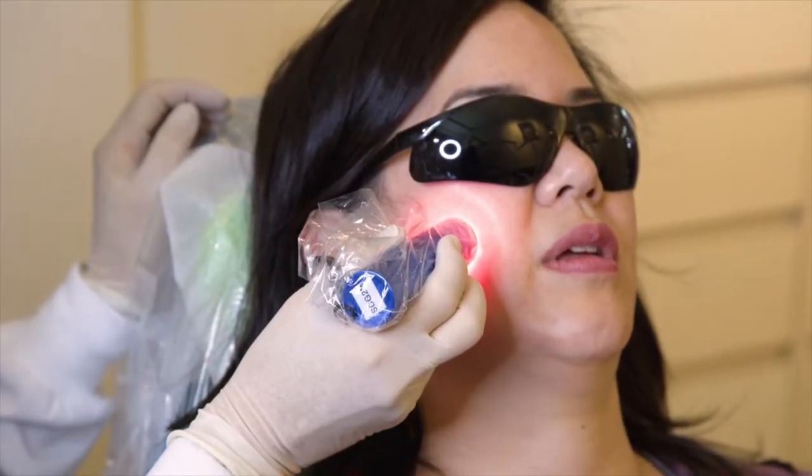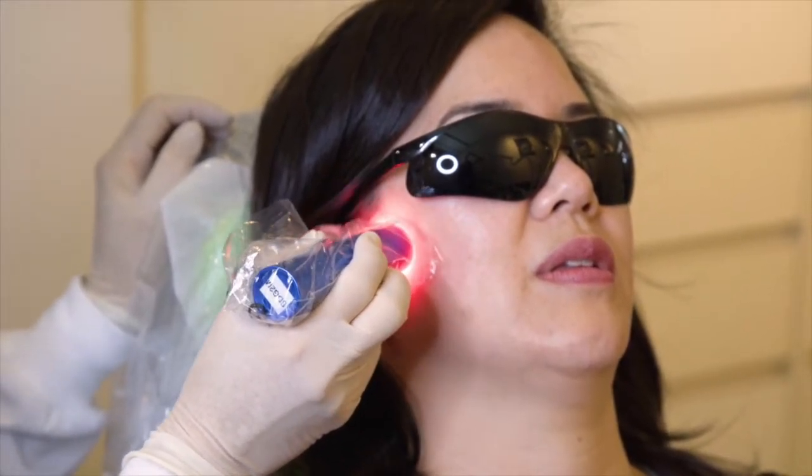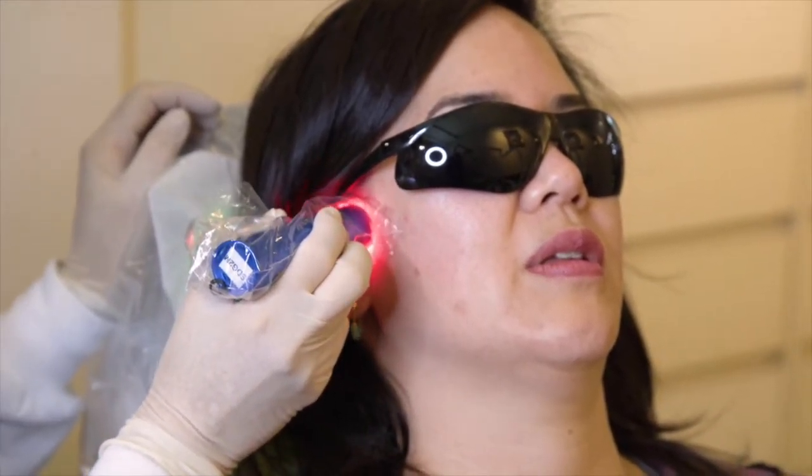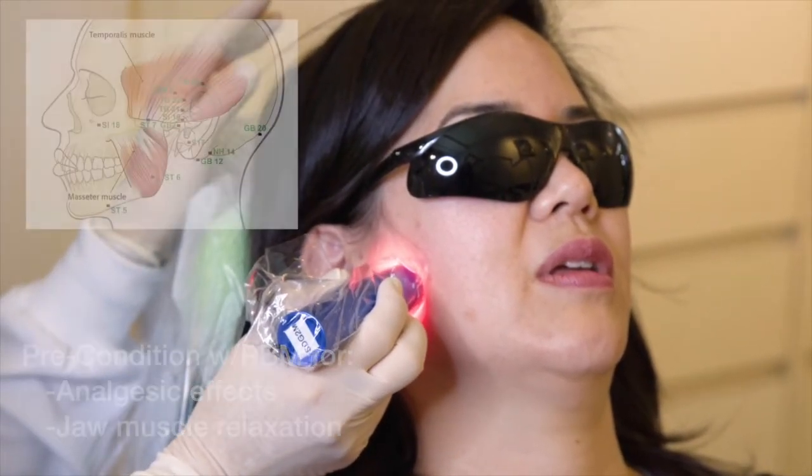You can see the light — it's got good coverage on the area. Most of the time for general dentistry, what we do is precondition the area we're going to be working on.